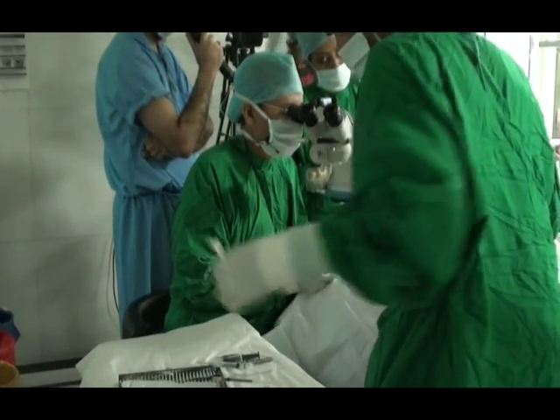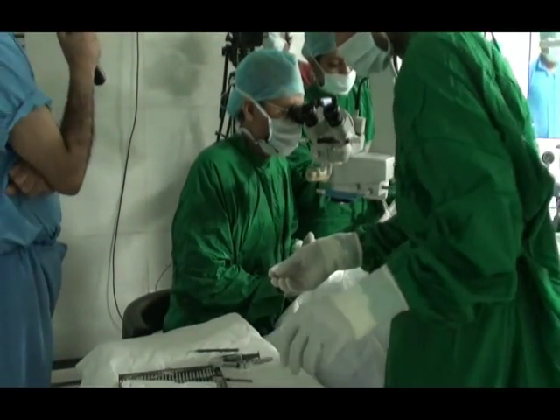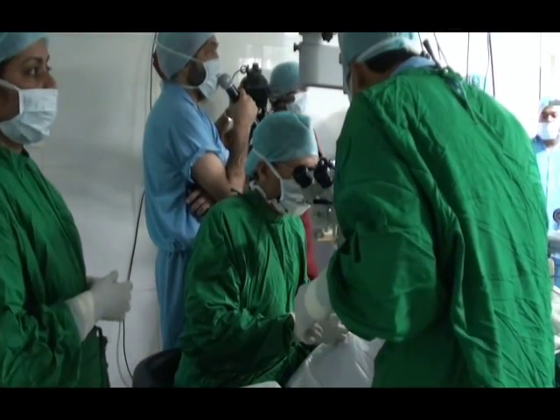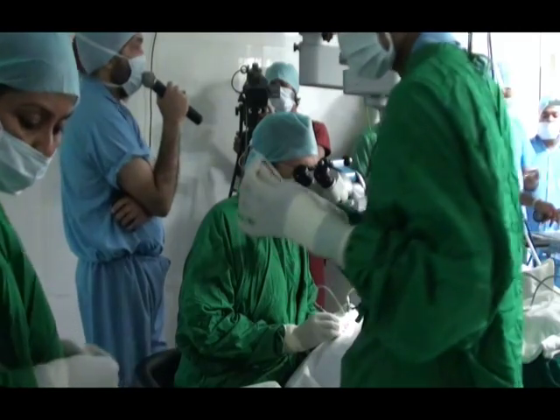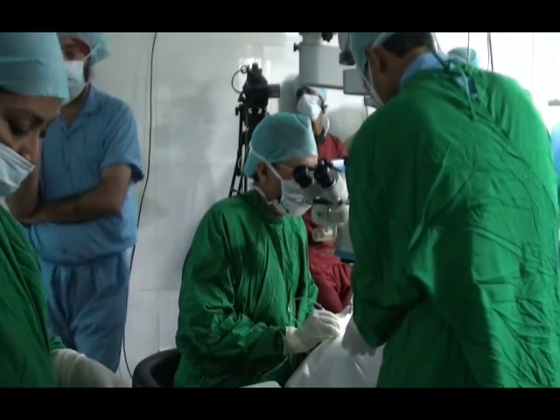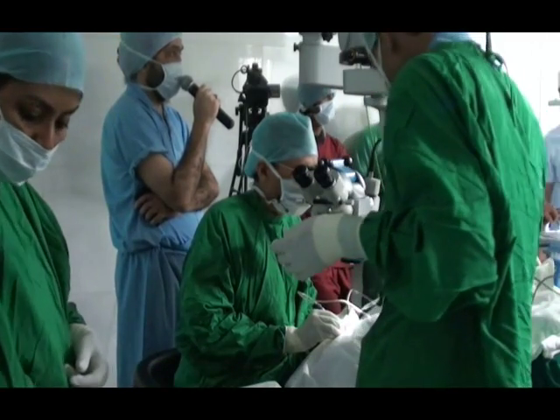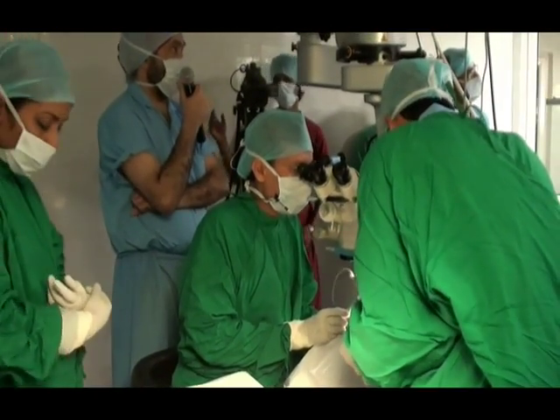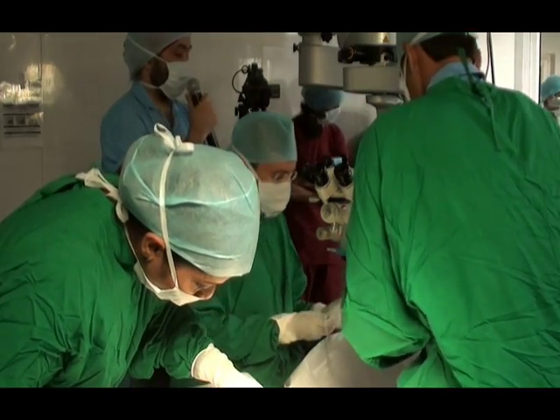Now I am going to do bimanual irrigation aspiration to remove the cortex. The advantage of bimanual irrigation aspiration is that you can have better access to the capsular fornices, and this allows you to clean up the capsular fornices more thoroughly. You can see the cortex is coming out. Now I am going to change the irrigation aspiration port.